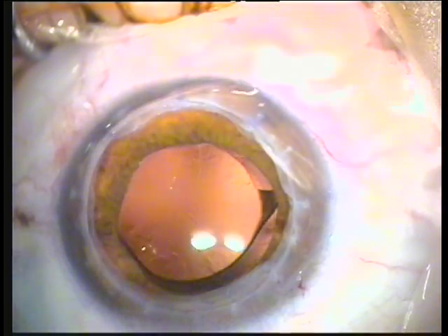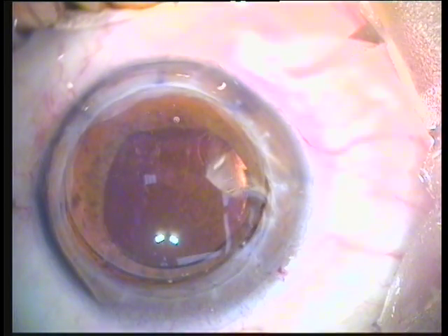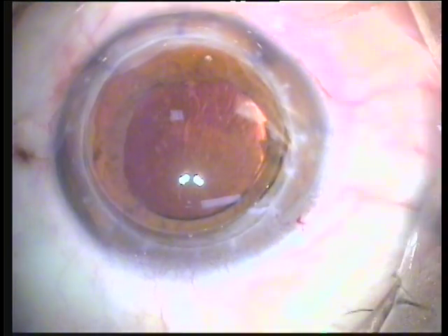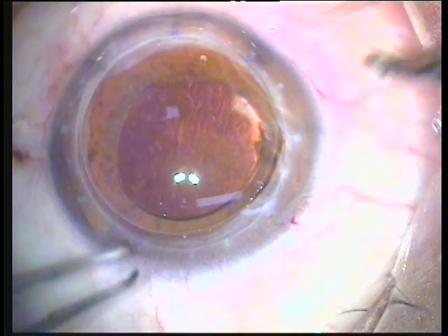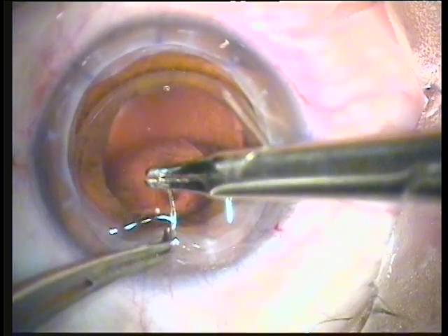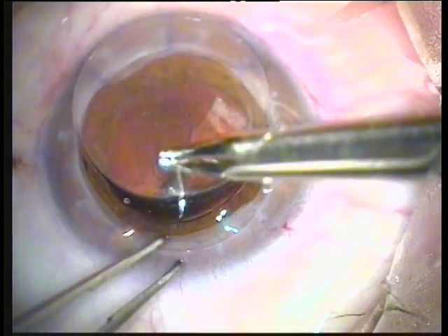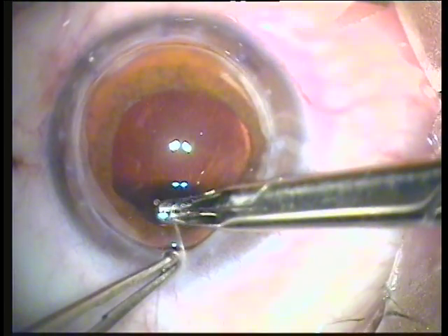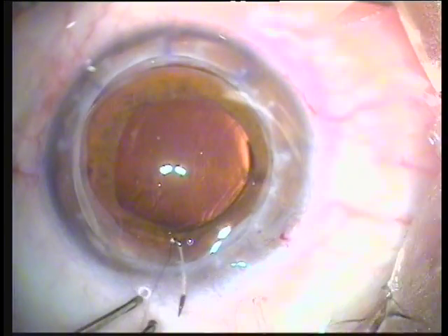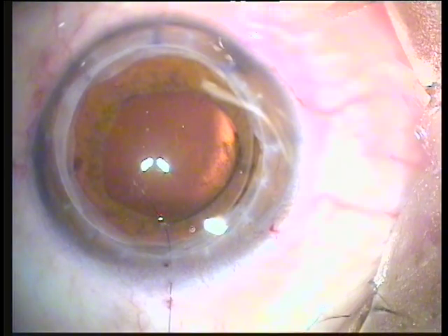Miochol will be used here to bring down the pupil, attain miosis, and lock the lens into position — also to avoid wicking from the iris pupillary margin to the graft-host interface. The cornea graft previously prepared to an 8.5 millimeter diameter is slightly oversized, just 0.25 millimeter oversizing from the trephination to the host. The cardinal suture is placed here; again, special attention is used for the suture to go as deep as possible, right over Descemet's membrane in the graft and at the same location right over Descemet's membrane in the host, through the 12 o'clock position. I remind you we're seeing the eye upside down through the surgeon's view.